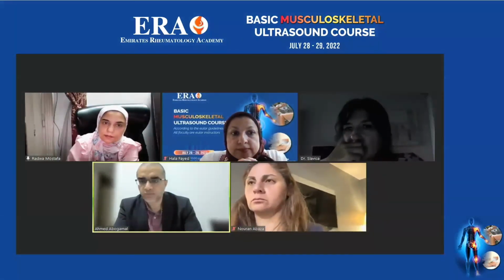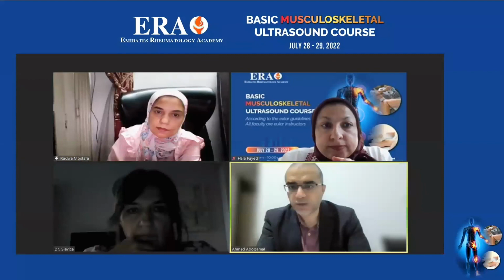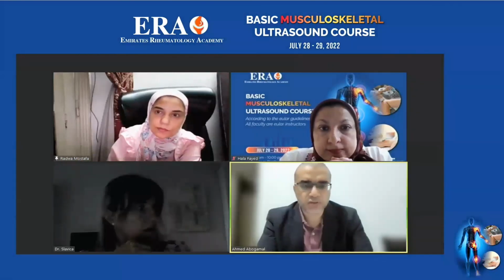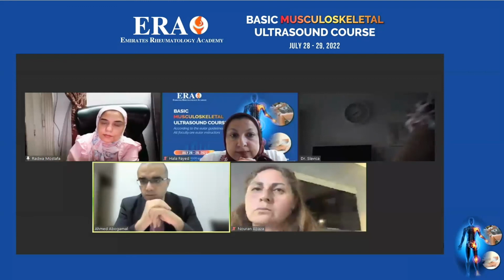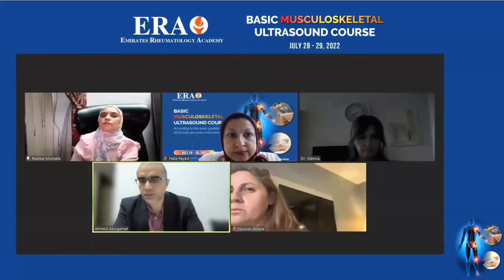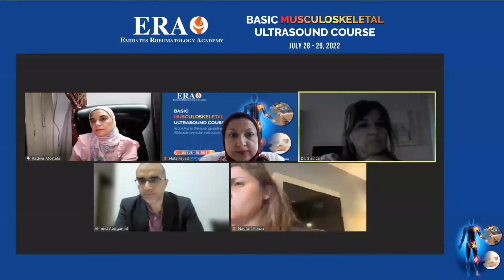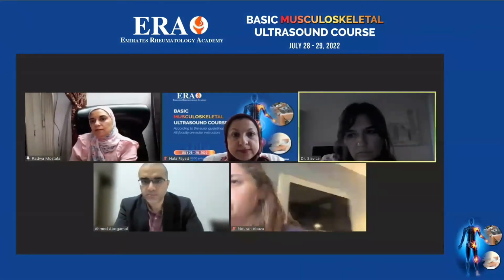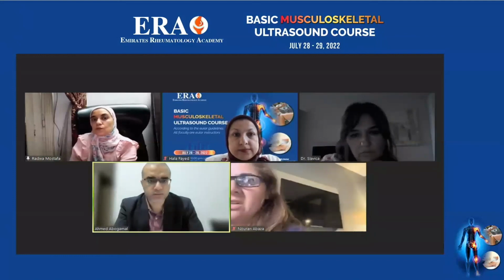We have another question from Abdelatif Al-Arfag about tendon thickness. Nuran, if you're going to measure the Achilles tendon, do you take the measurement after the paratenon or including the paratenon thickness? Nuran, can you hear us?